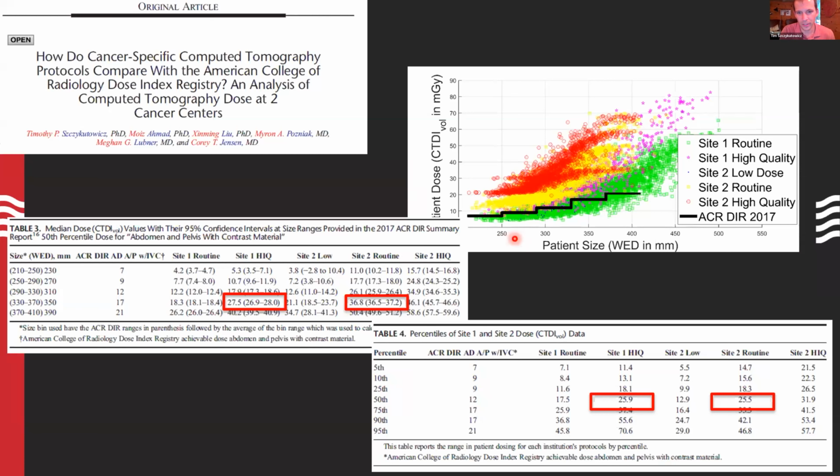Who really cares exactly what these specific values are at the end of the day? I think what you're using this for is a way to view your data that lets you identify the problems I talked about today, not so much that one is fundamentally better than the other. In practice, if I had to pick, water equivalent diameter is probably the best, because it's usually going to have the tightest distribution of dose, since that's the closest thing to what the CT vendor's black box AEC algorithm is going to use for its dose calculation.